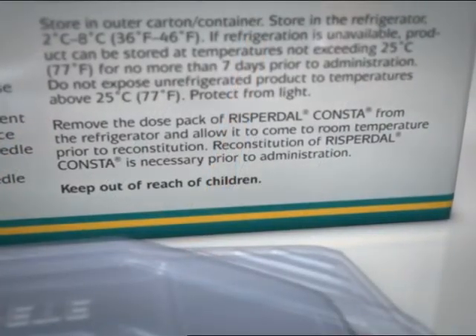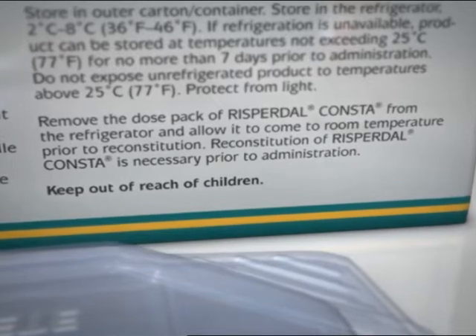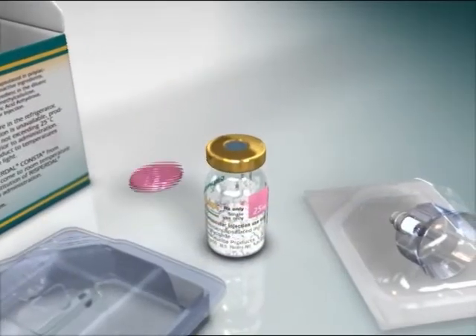To begin, remove the dose pack of Risperdal Consta from the refrigerator and allow it to come to room temperature prior to reconstitution. Then flip off the plastic colored cap from the vial.